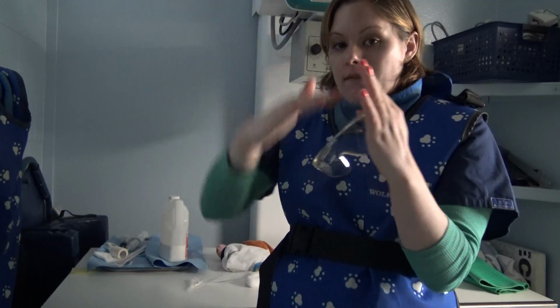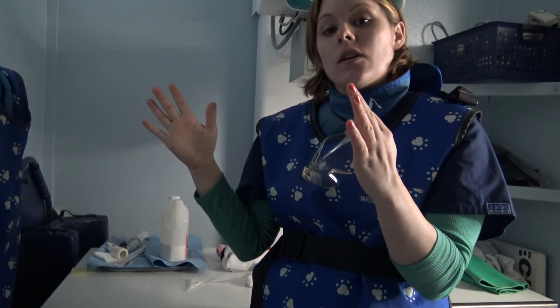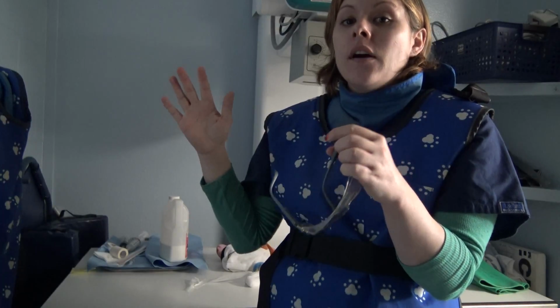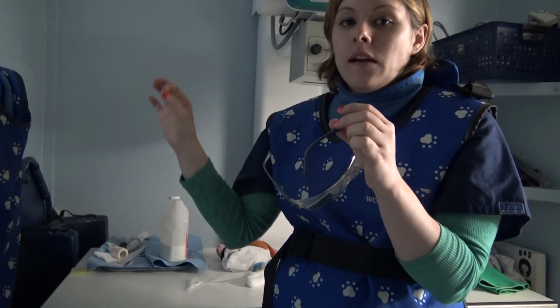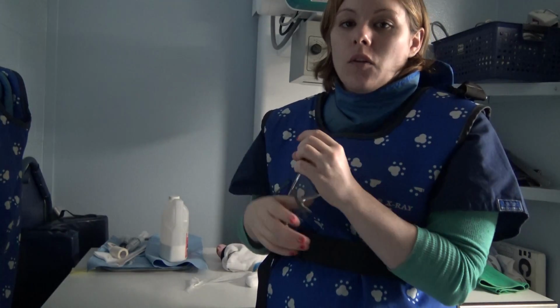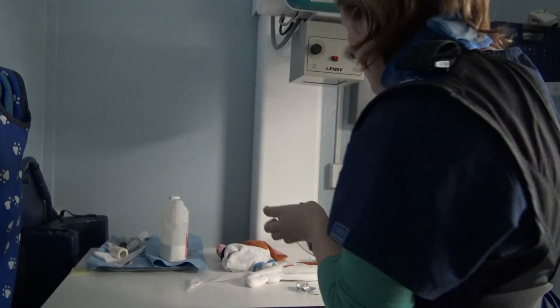You want to make sure you have the whole abdomen in there. You want to make sure you go to the coxofemoral joint. And you want to make sure you have good contrast so you can see the grays and the different parts of the abdomen, and then the black is black and so forth around the x-ray.